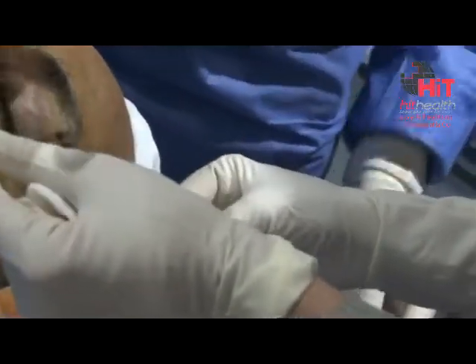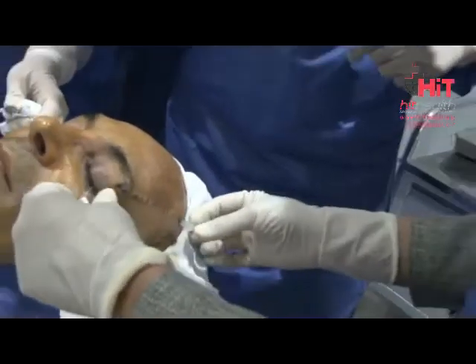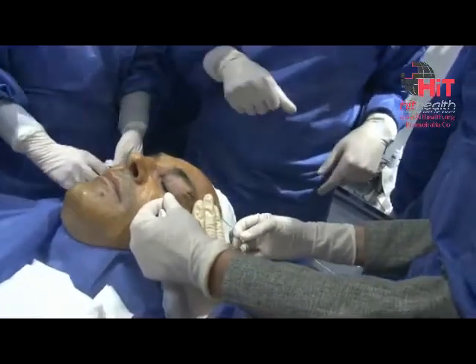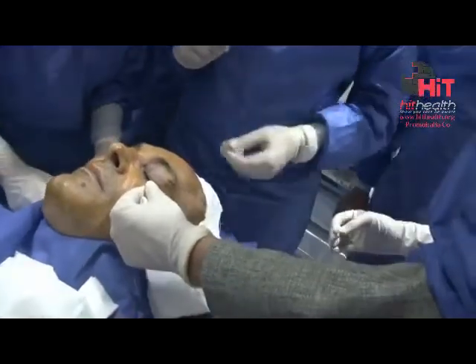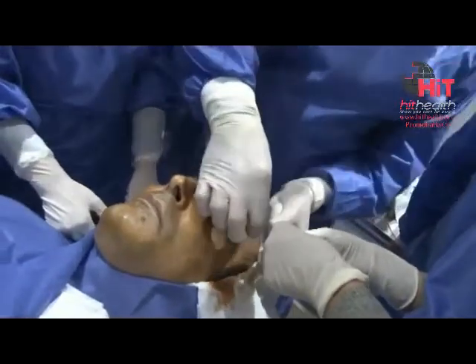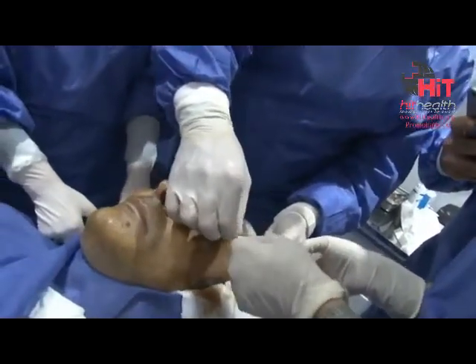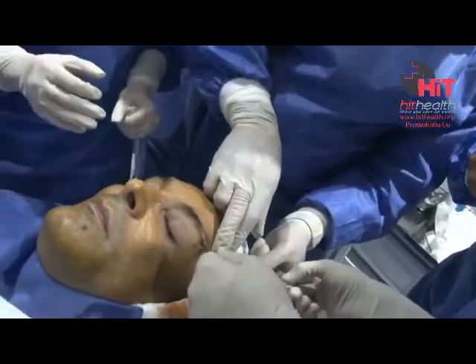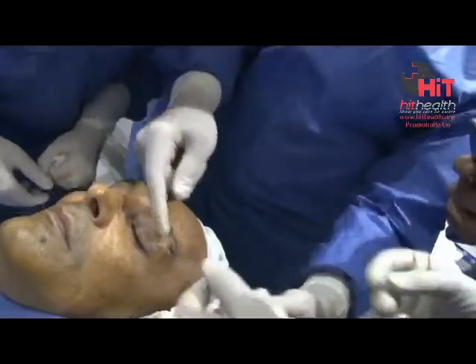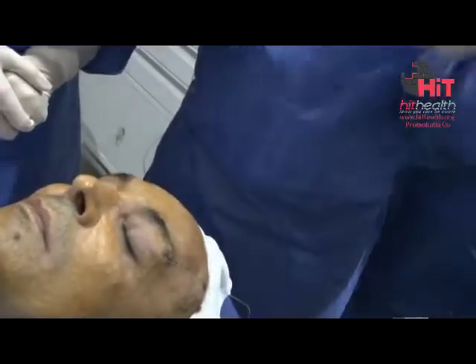Now it's very important the same distance from left and right part, stopping the threads — remove, remove the cannula. Perfect. Now pull in this way and after make this movement — open. Open eye, remove the skin, but a little bit because this is a man, a strong man — a little bit.